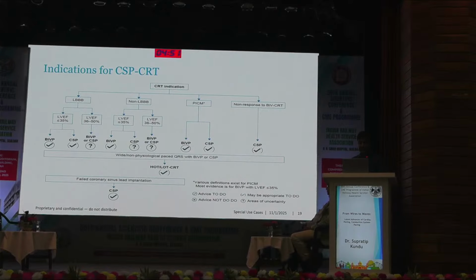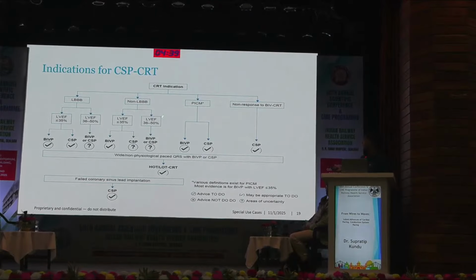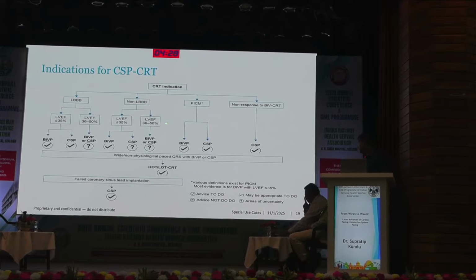Indications for CSP and CRT. In non-LBBB cases where LVEF is 36 to 50%, CSP is useful. These cases are not a typical indication for CRT, but we can use CSP in this type of cases.